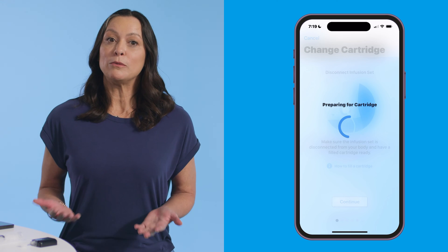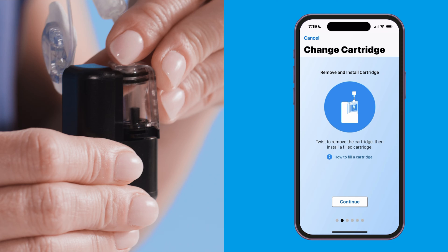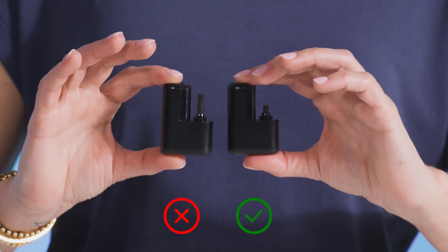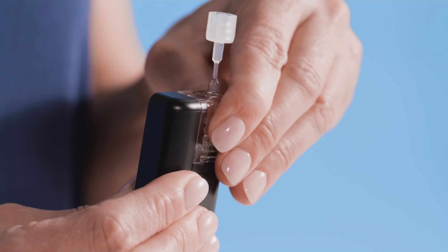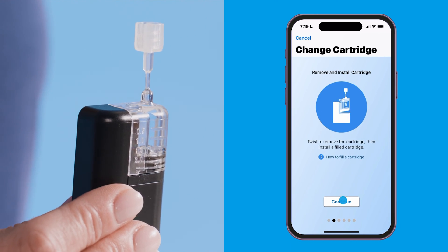You'll be prompted to remove the empty cartridge from the pump by rotating it counterclockwise. Be sure the piston on your pump is in the down position — it should look like this, not this. Now, place the newly filled cartridge on the pump and rotate it clockwise until it clicks into place. Then tap continue.